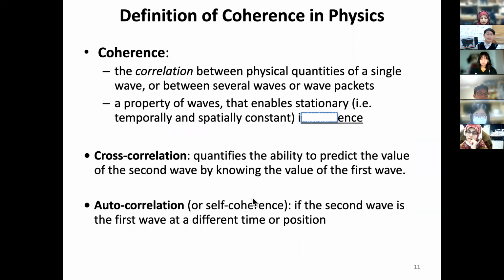So how come it's possible? And we have to go back to our basics. So now I want to go one by one with you through some of the fundamental definitions which form the basis for OCT.